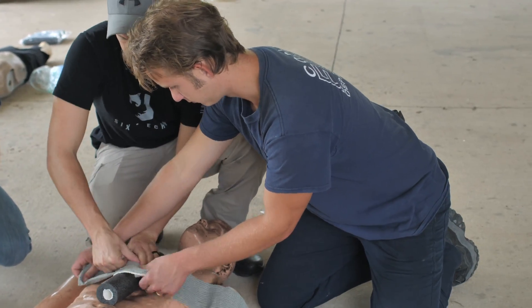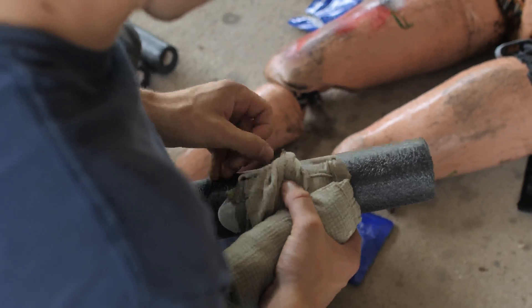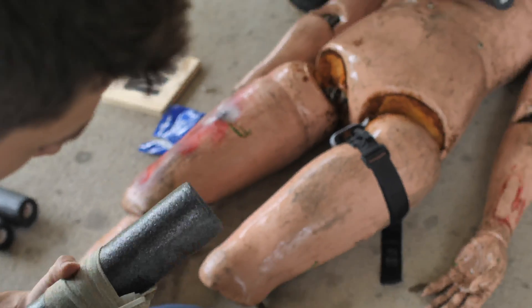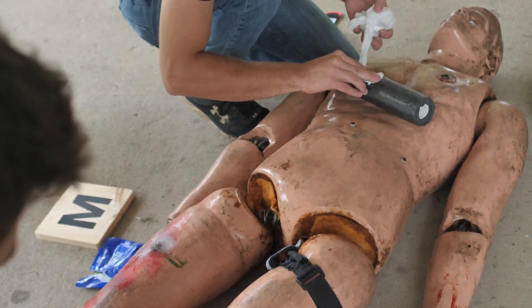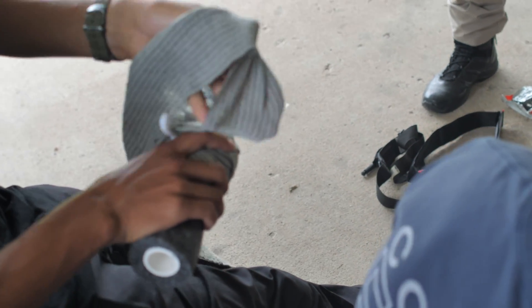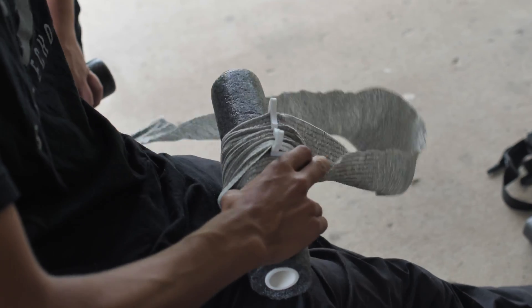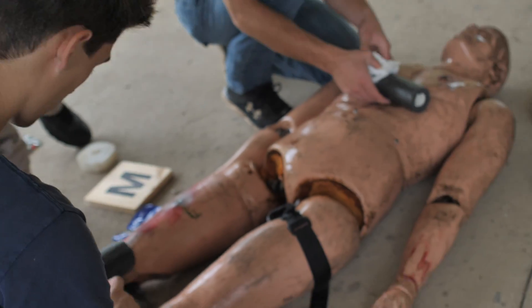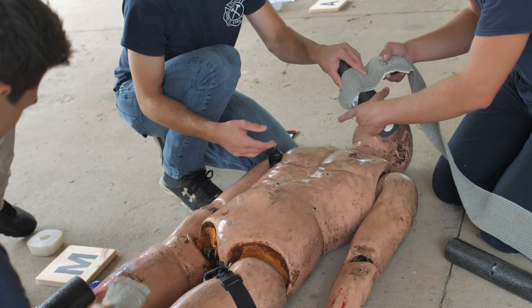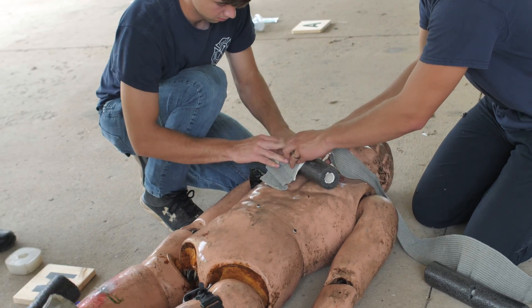You can use regular gauze for this — pack it in the wound and just hold pressure. Combat gauze has a kaolin clay in it which absorbs moisture and causes it to clot faster. When using QuikClot or combat gauze, hold direct firm pressure for three minutes. That doesn't mean you have to use your hand — a pressure dressing works, but it needs to be tight enough to hold good pressure for three minutes. If you use regular gauze, hold for ten minutes.